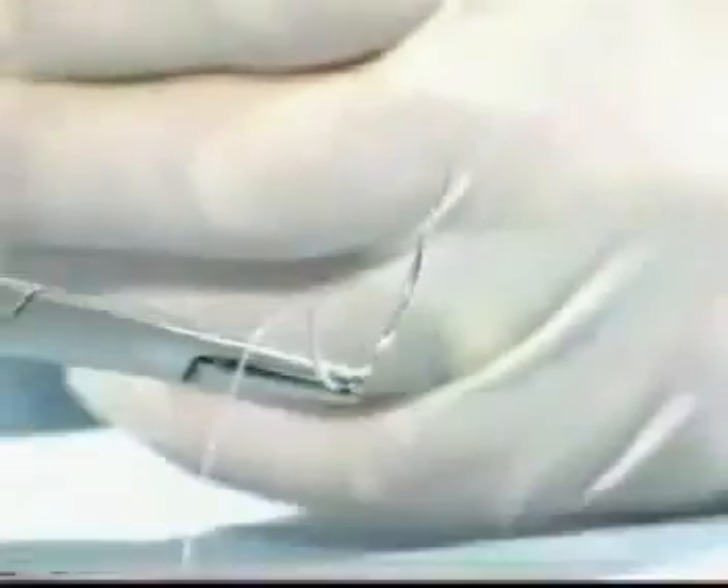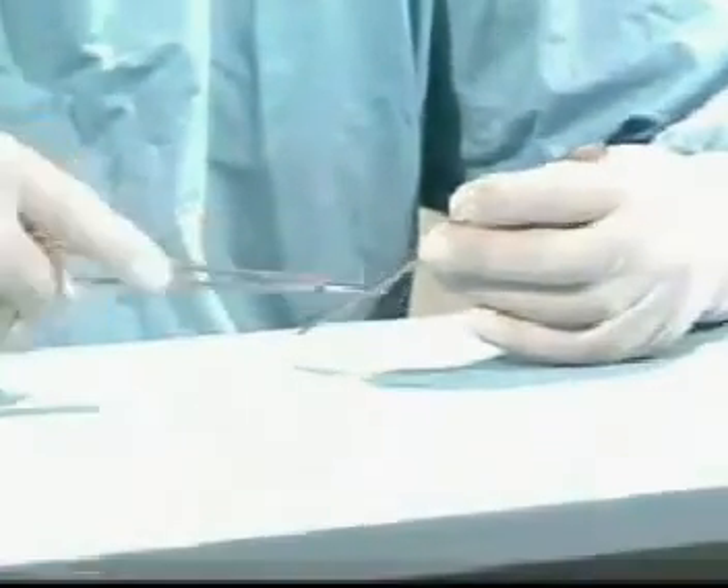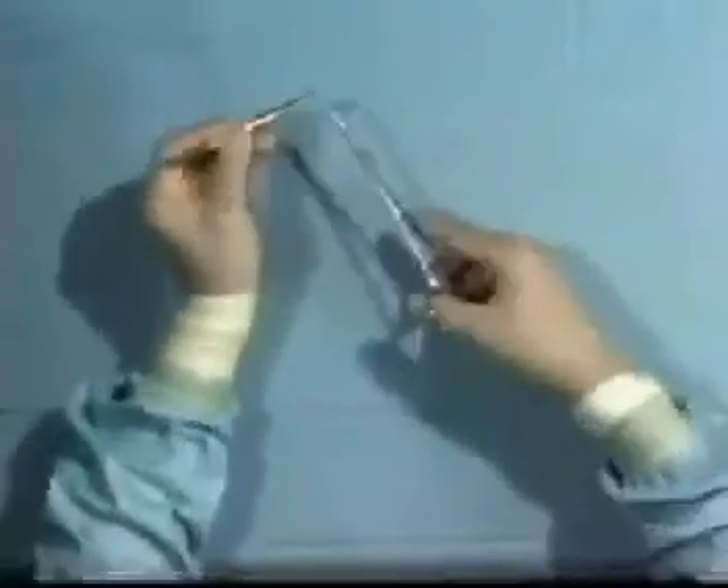Insertion of sutures requires a smooth supination of the forearm. Occasionally a backhand suture is required, in which case the needle position can be changed in the needle holder, enabling you to insert a backhand suture. This is an exercise of forearm manipulation, with one arm pronating and the other supinating synchronously — one arm pronating while the other arm supinates, allowing the needle to be changed from forehand to backhand.